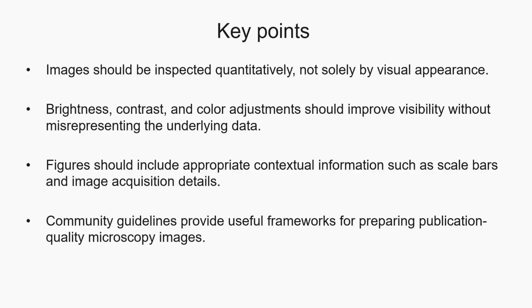To conclude, quantitative image inspection is about looking beyond image appearance and understanding what the data actually represents. The way we display images through color selection, brightness adjustments, and contrast settings can substantially influence how viewers interpret the results. For this reason, image presentation should always aim to improve visibility without altering the scientific message.